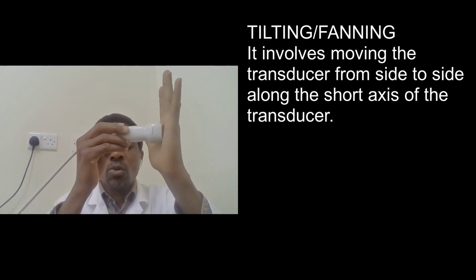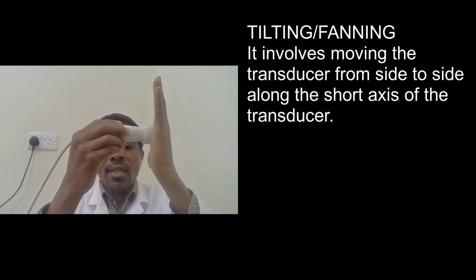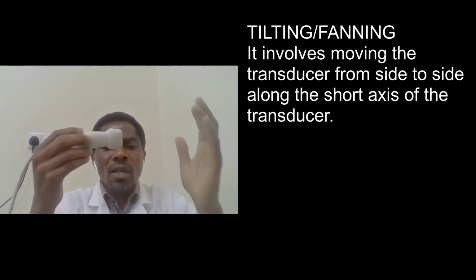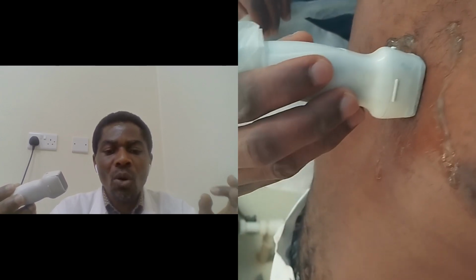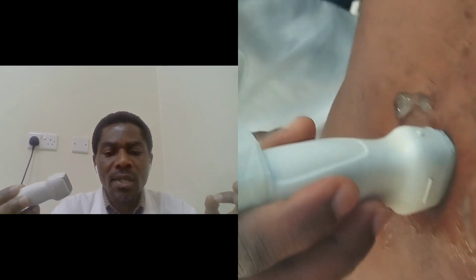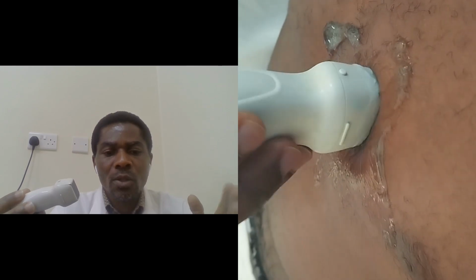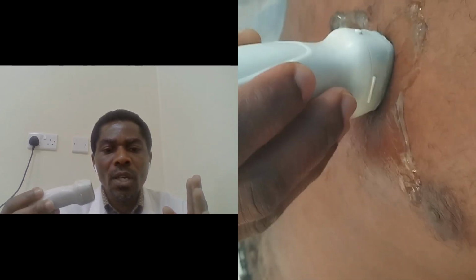You can move it to the left, then to the right, or any direction that you want, but move it in this short axis. Tilting can help us to visualize multiple cross-sectional images of the structure of interest. So when you are tilting, it's like you are trying to slice the structure of interest.